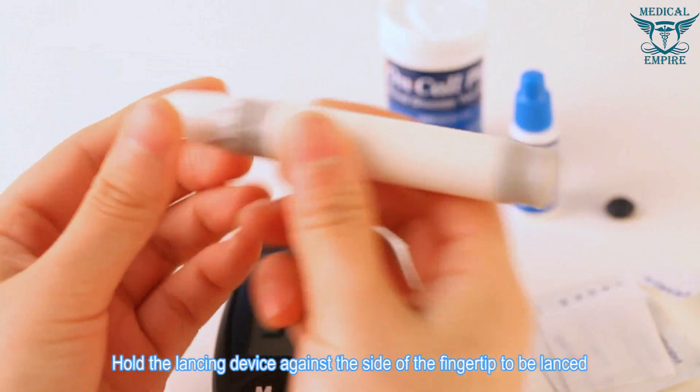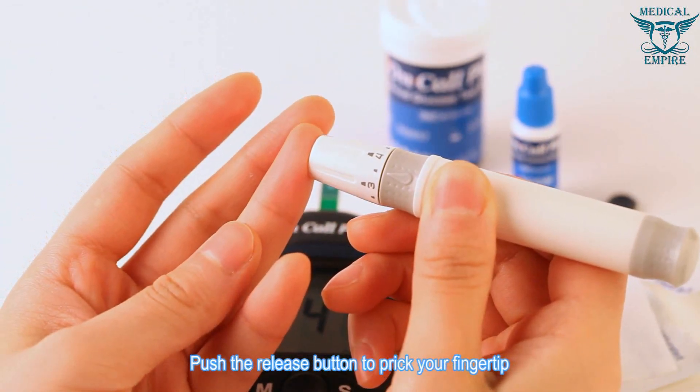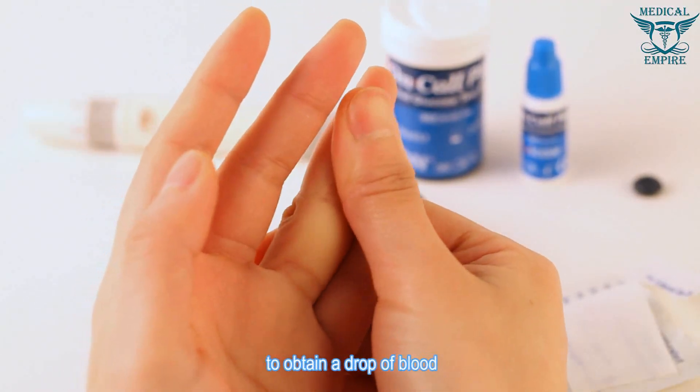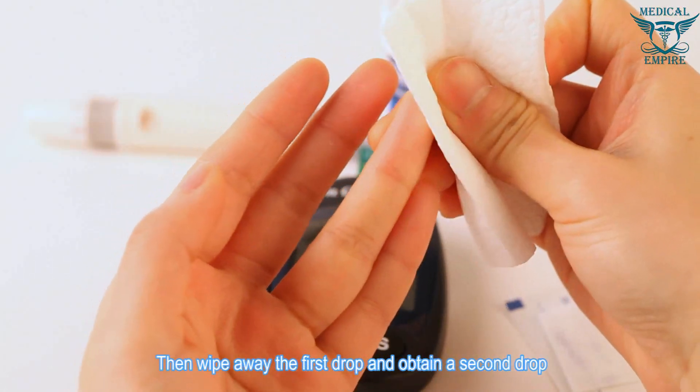Hold the lancing device against the side of the fingertip to be lanced and push the release button to prick your fingertip. Gently massage from the base to the tip of the finger to obtain a drop of blood. Wipe away the first drop and obtain a second drop.